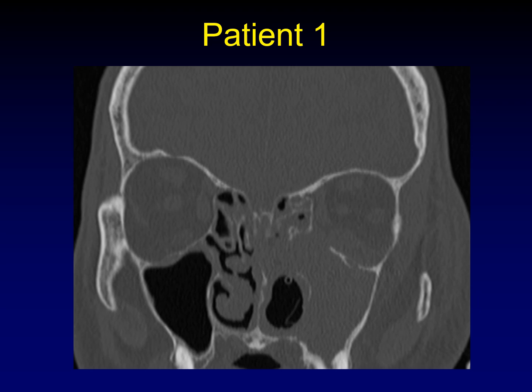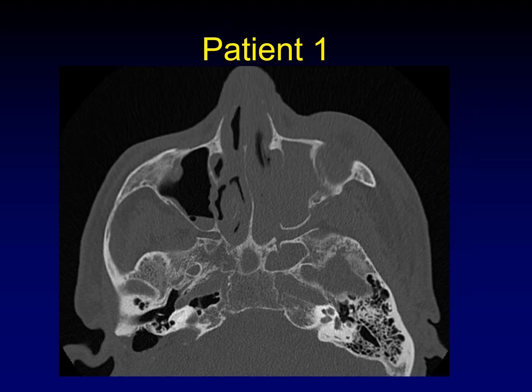Here's patient number one. This is a coronal CT, and you can see that the left maxillary sinus is completely filled, and something is spilling out into the nasal cavity. Here's an axial image on patient number one, where you can see the effect that the mass is having on the medial maxillary sinus wall.